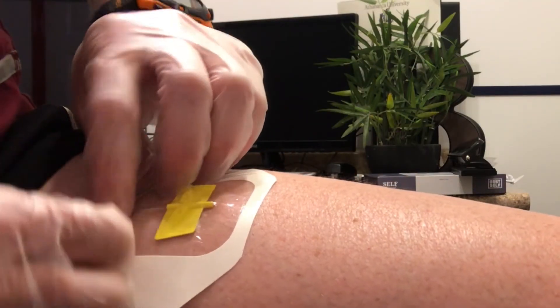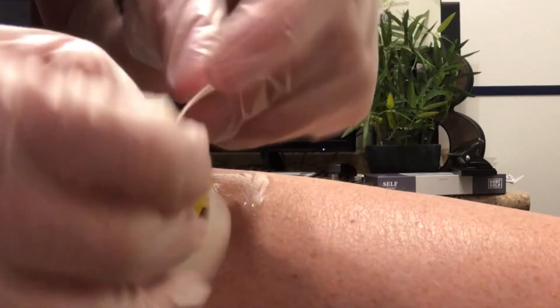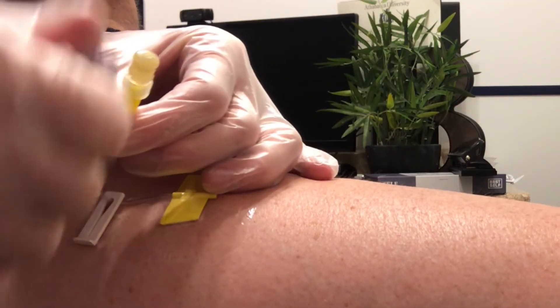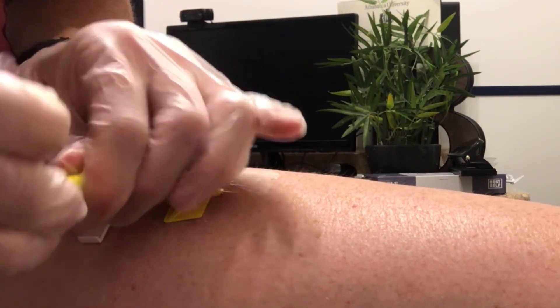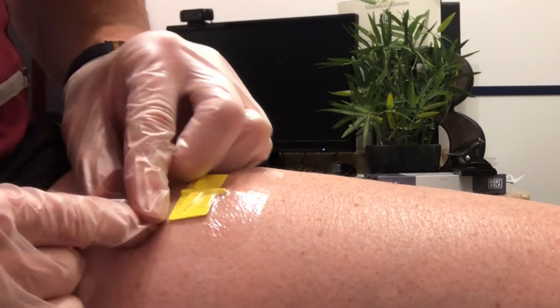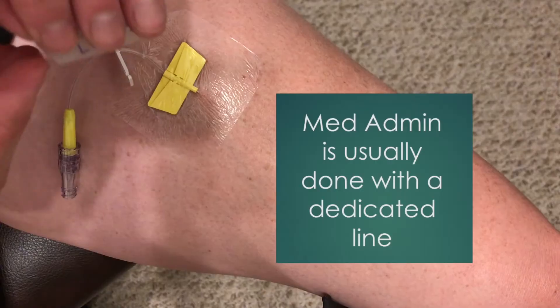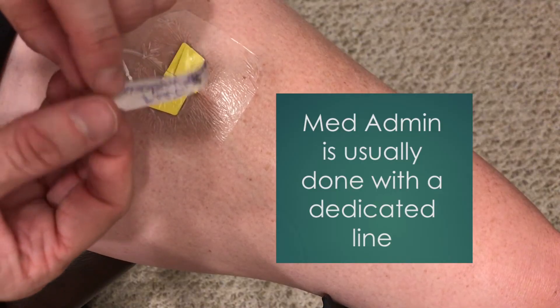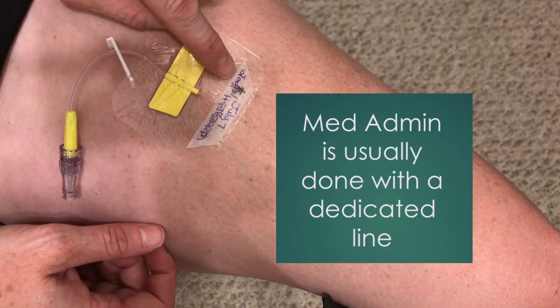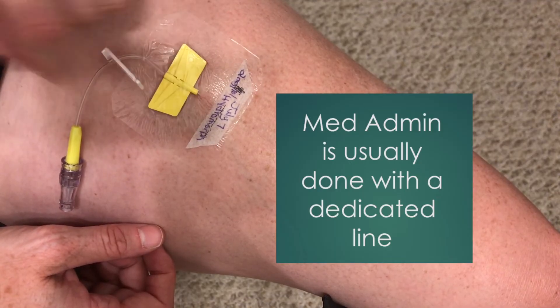Pull off the backing and ensure we have a nice seal all the way around our tegaderm. We can then exchange the cap for a neutral connector. All that's left is to lock off the line and put our label on it. The label needs to have the date of insertion, the type of drug, and the concentration of the drug, because this is going to be a dedicated line.